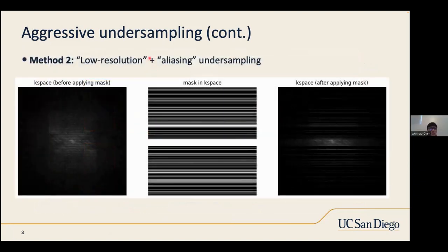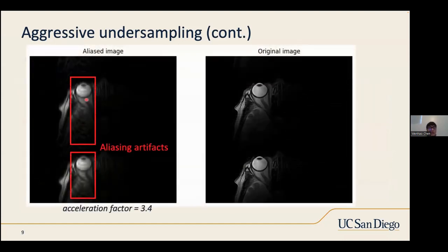Okay, then we consider aliasing and ringing at the same time. The binary mask in the middle samples the low frequency region moderately, and the high frequency region is sampled too, but only randomly with some random interval. The purpose is to see if our deep learning method can remove moderate aliasing artifacts also. As you might expect, aliasing artifacts are prevalent in the left image.